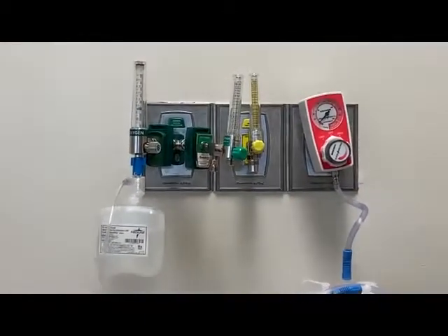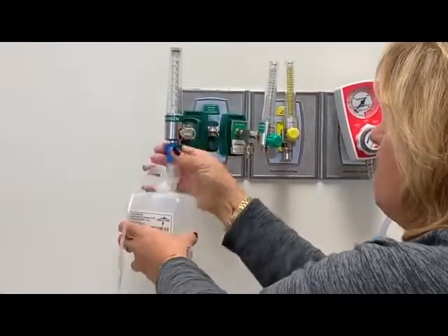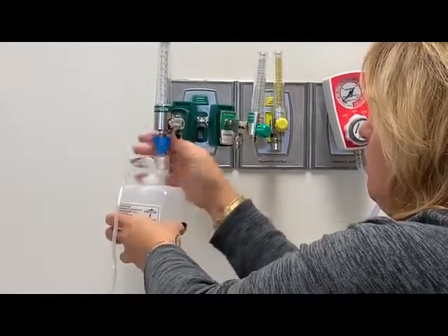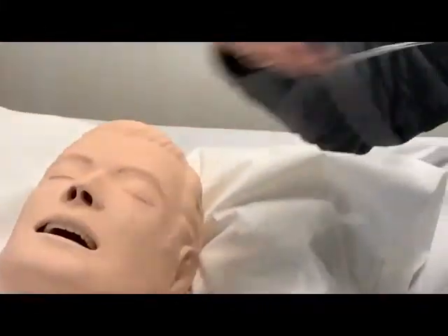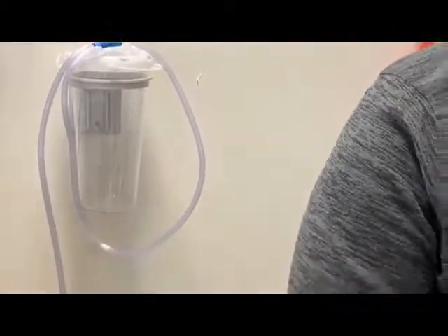The next device that we'll go ahead and move to is going to be our simple mask. So I'm going to go ahead and take this off. Take that off of our patient. The next device is our Simple Mask.